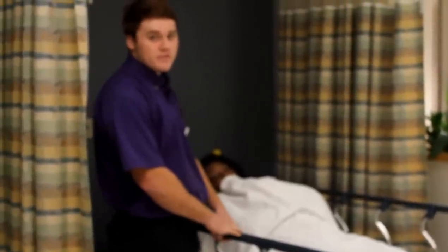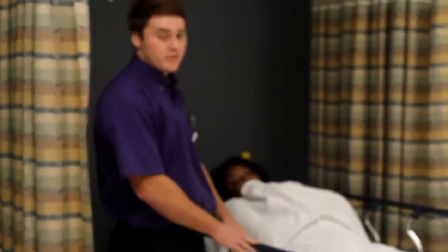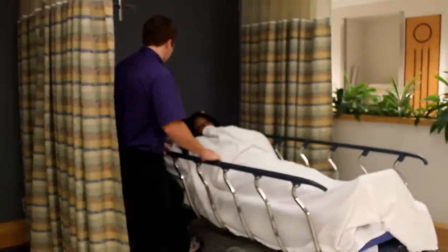Today we're going to learn how to transport patients safely through the hallway. After you check the wristband and make sure you've got the correct patient, you're going to raise the stretcher to your height, so it makes it easier to push them through the hallway.